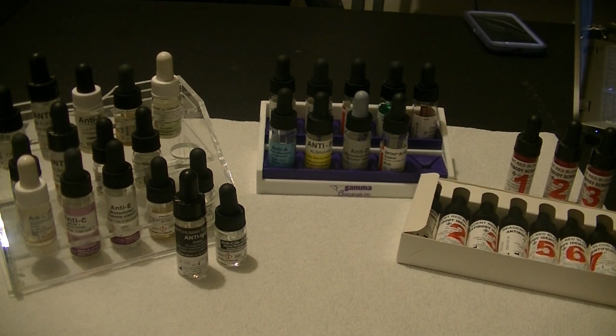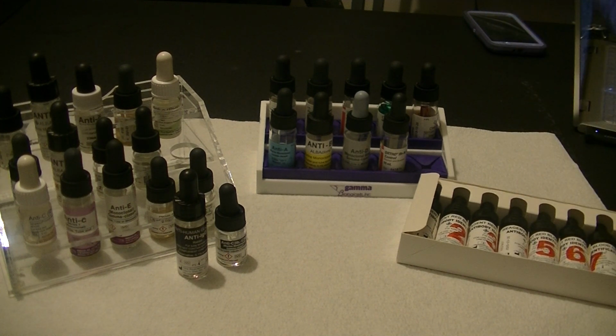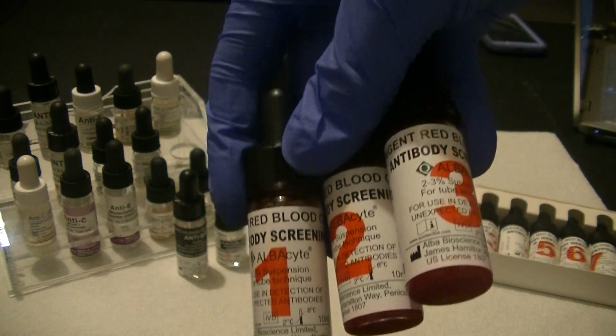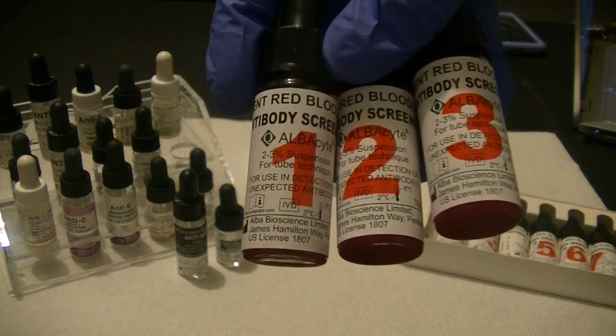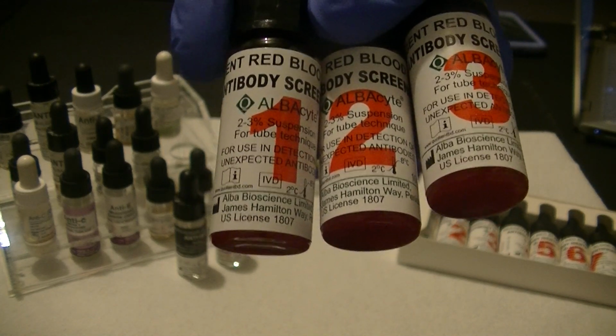Another type of reagent red blood cell is the reagent red blood cells we use in the antibody screen. Notice it says antibody screen on all of these cells, and we use these 3 cells in a test to see if a person has antibodies other than anti-A or anti-B.